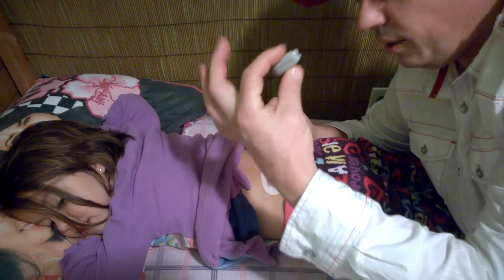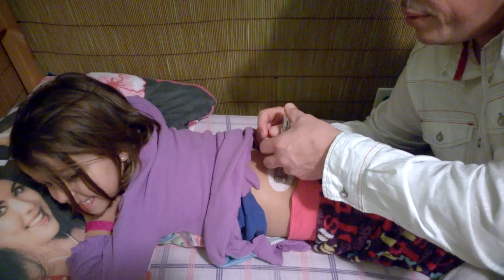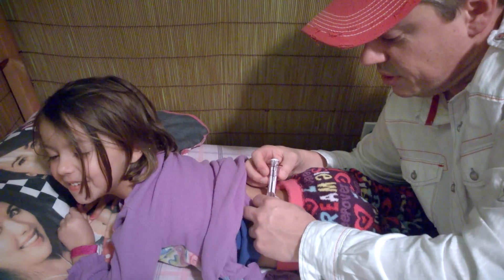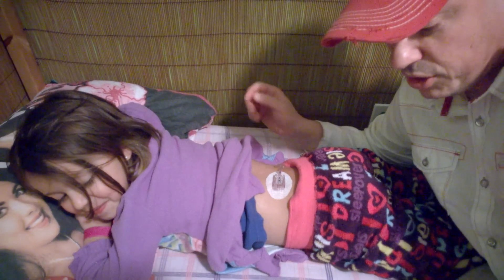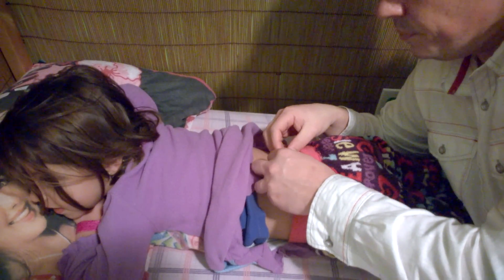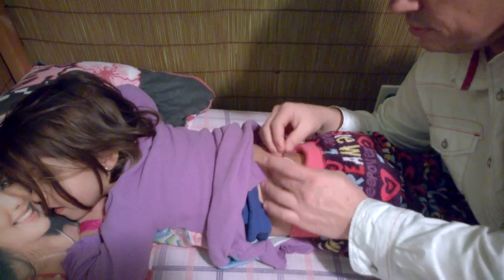We're going to pull this off. When Livia says go, I'm going to get the sensor ready and put the sensor in. Ready, set, go! It didn't hurt at all. So we've got it there — we're going to pull this out, grab the sensor, make sure that it's clean, line it up with the holes, push it in, snap it, pull the back out, and we're done.